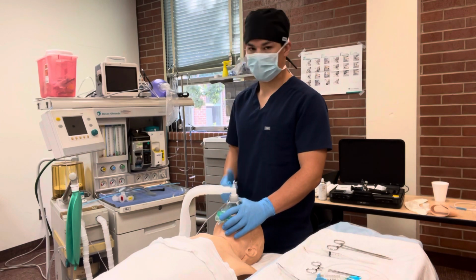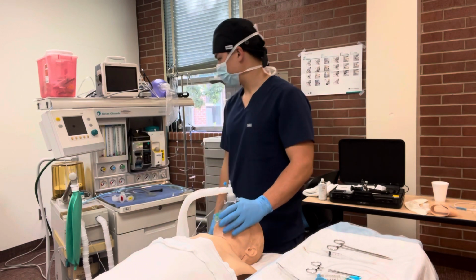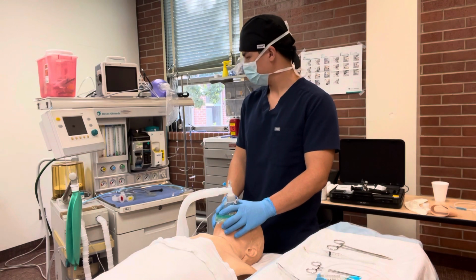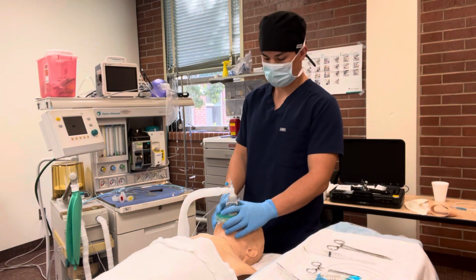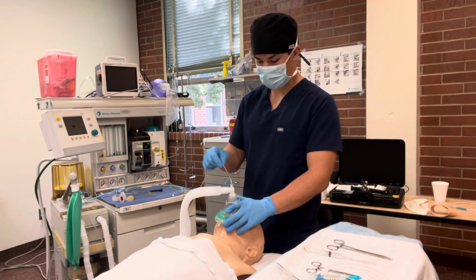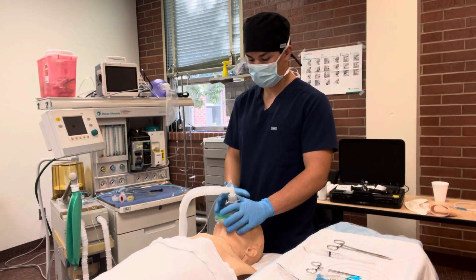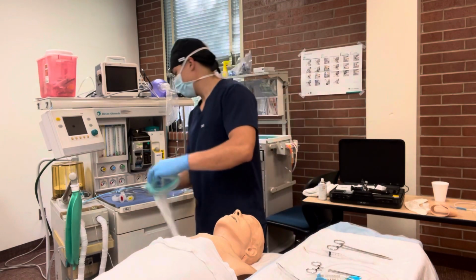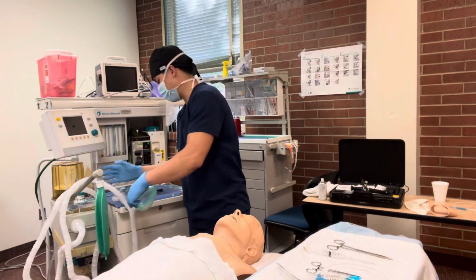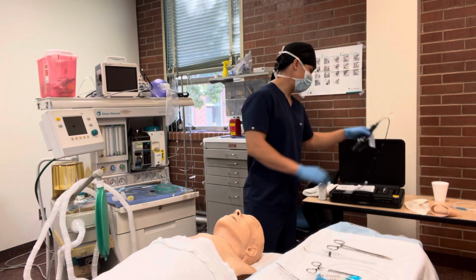So I'm gonna grab my bougie. I can do a fiberoptic bronchoscope, or I can grab a video laryngoscope, another set of hands, a trach light maybe. So I'm gonna do a fiberoptic bronchoscope. I'm going to grab my supplies, which is a fiberoptic bronchoscope, an ET tube, some lube to not damage the fiberoptic scope.